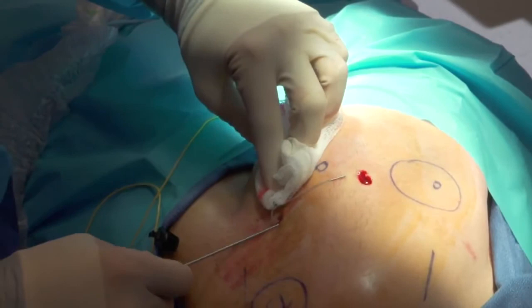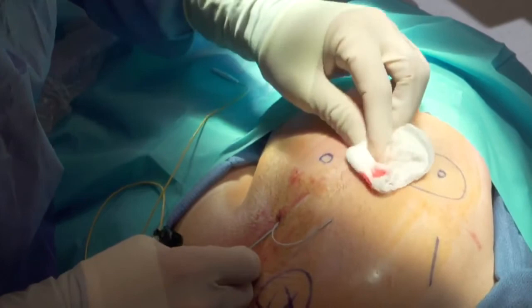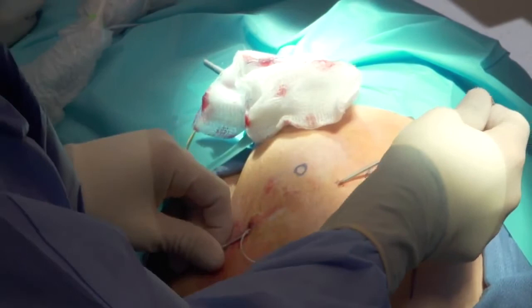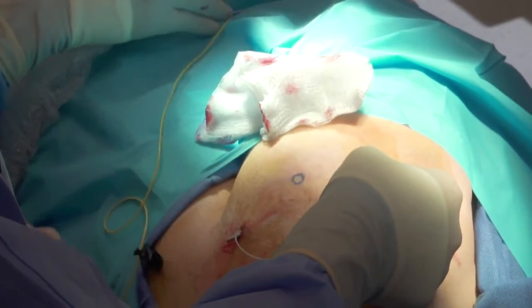Again, always know where your needle tip is. And as we come through, you're utilizing this, so you need something to feed the lead back. You place the hub on top. Now, be careful, taking care not to stab yourself out the other end. Once you come through and you see the lead, that's when you remove. Michael, you may use some forceps here.